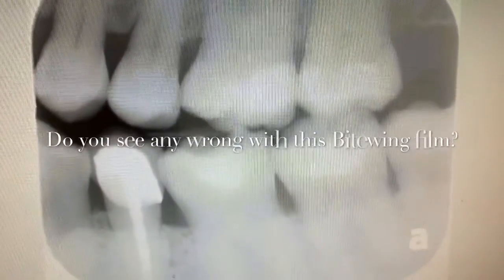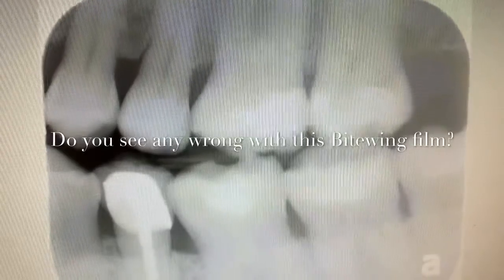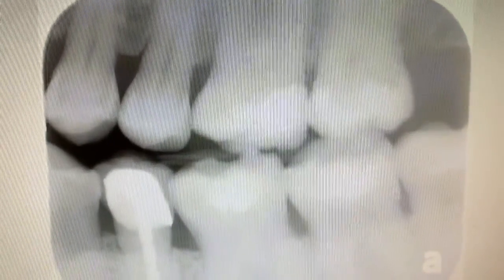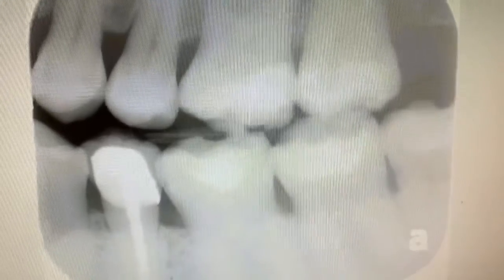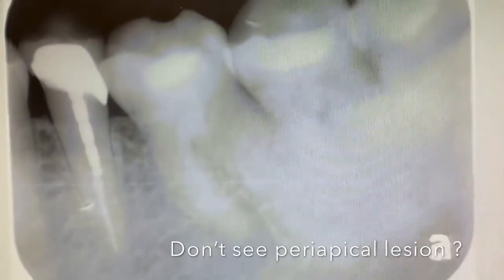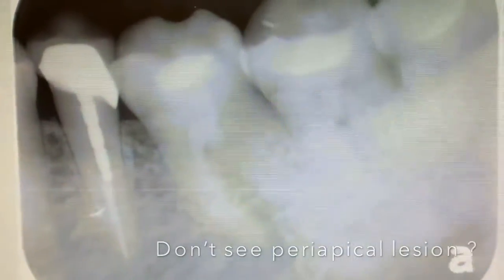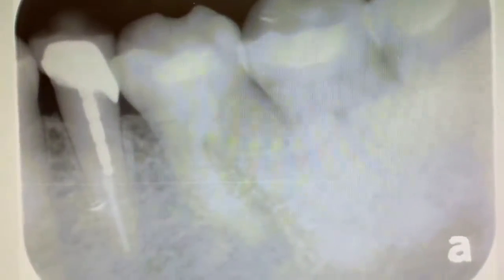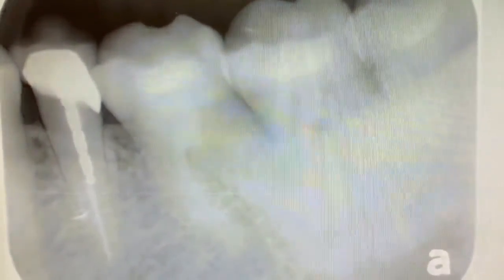I took an X-ray and a panoramic, also the bitewing, and you don't see anything wrong besides there's a filling done, and the X-ray looks pretty typical, a normal scenario. However, as you noted, there is a slightly irregular shape of the enamel with the restoration done. On the X-ray, you don't see much of an abscess or any type of potential emergency situation when you look at the periapical X-ray.